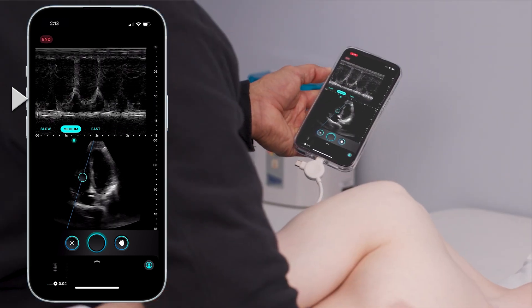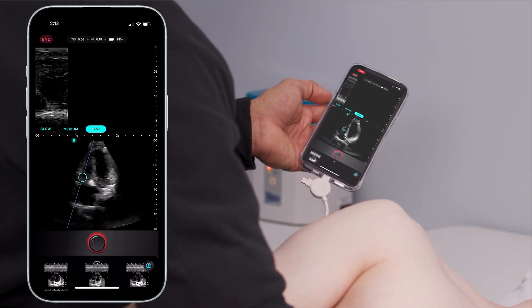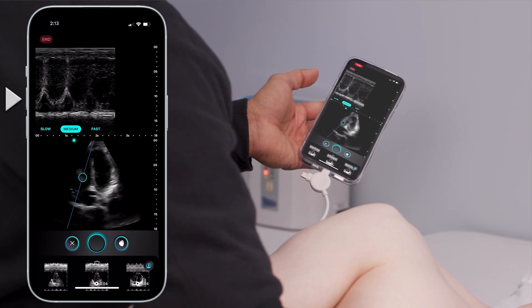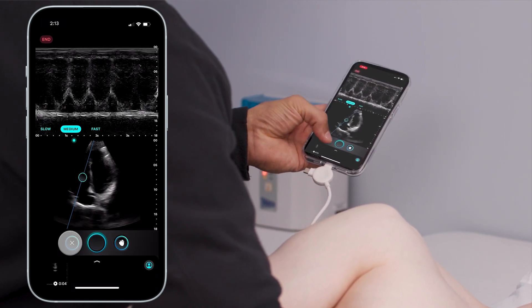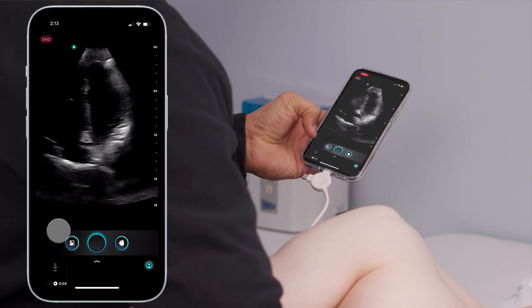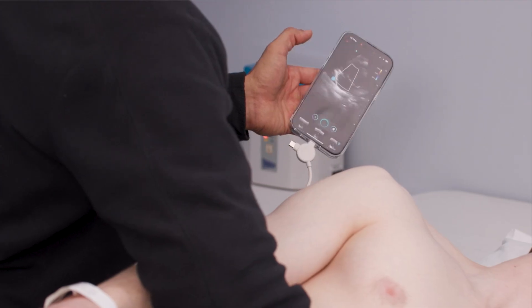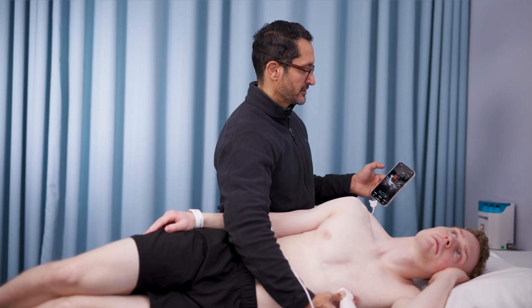If you want to record a video, push a button — predetermined 4, 6, or 2 seconds, whatever you've decided. Hit still, push a button. That's how you record; that's how you capture. You can also hit color, and right away I can see by moving my box that this patient doesn't have any kind of tricuspid regurgitation.